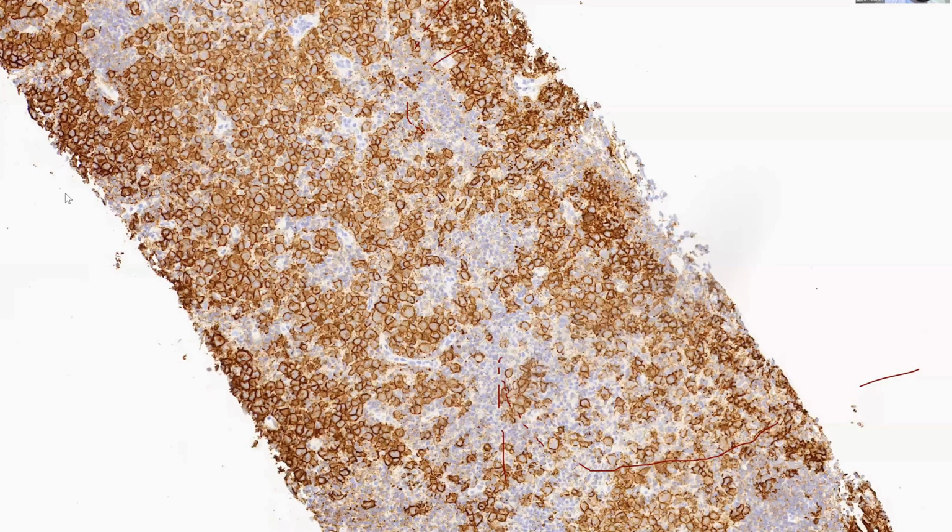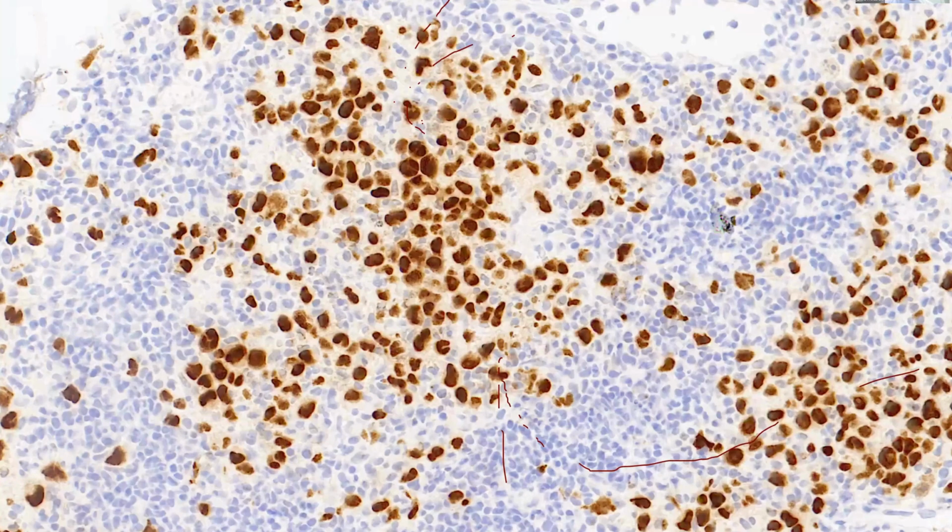CD15 was negative, so that was helpful in determining that this is just a diffuse large B-cell lymphoma. And just to add, PAX5 in this case showed very strong positivity rather than weak positivity, which indicates a full expression of this. So this was a diffuse large B-cell lymphoma.